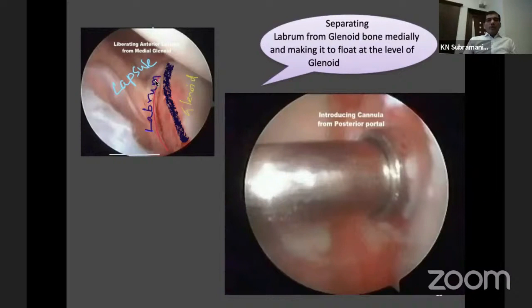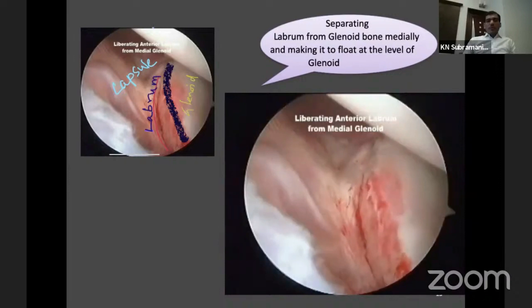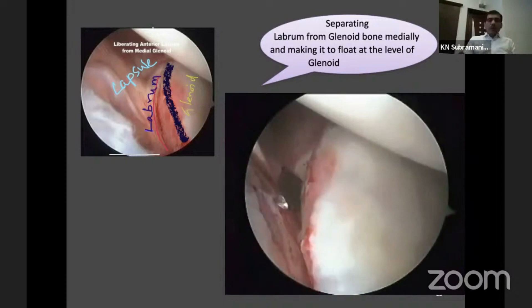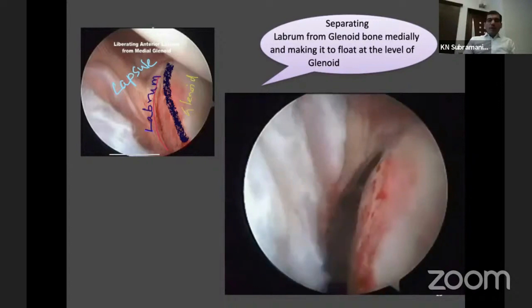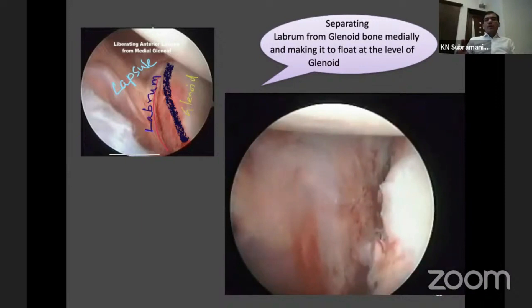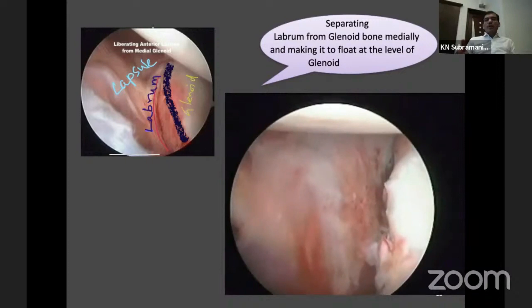Moving to the anterior portal, you can see the structures: this is the labrum, here is the glenoid, and that is the capsule. This labrum has gone medially — it is displaced due to several dislocations. The next step is to establish the posterior cannula. You have to bring the labrum which is displaced medially back out — I usually do it from the most inferior end, so that you can detach it slowly from the inferior capsule and take it in one piece without any fragmentation of the labrum. It has to come back to the level of the glenoid bone.